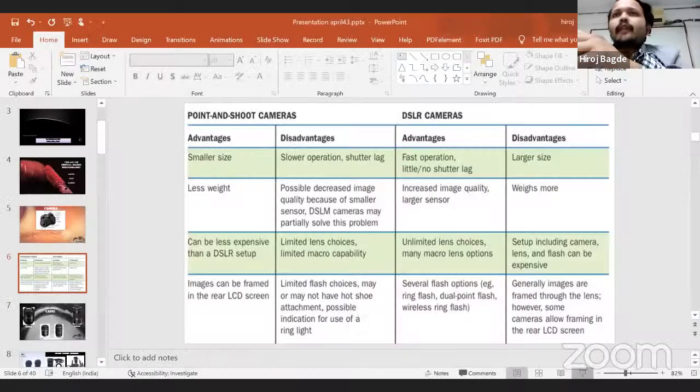So there were two different kinds of cameras. Amongst them, we have SLR and DSLR, single lens reflex, as the full form is. We have a category of different kinds of lenses which can be attached to this kind of DSLR. But what about point and shoots and mobiles? We are not able to do such things. So we have evolution of different kinds of lenses.